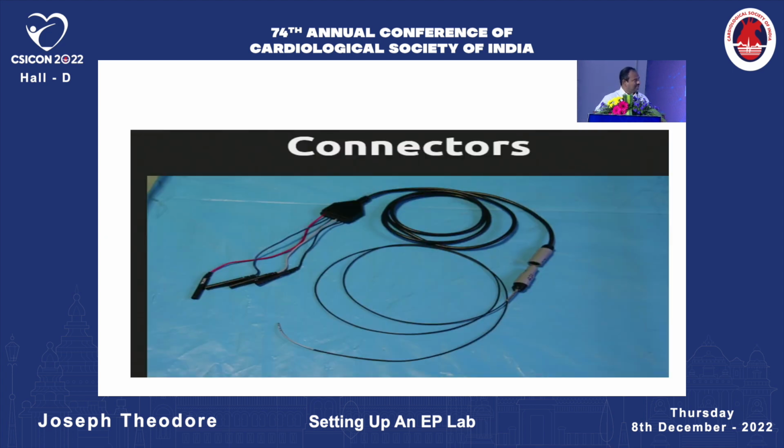Going back to the connectors, from the catheters you get connectors which will have pins which get inserted into the junction boxes. Usually the distal pin is coded red. The distal pin will also carry the smaller number. That is, if a quadripolar catheter is used, it is 1, 2, 3, 4.